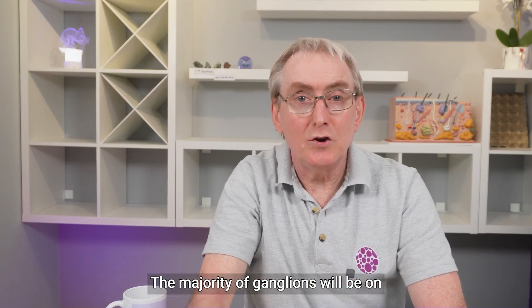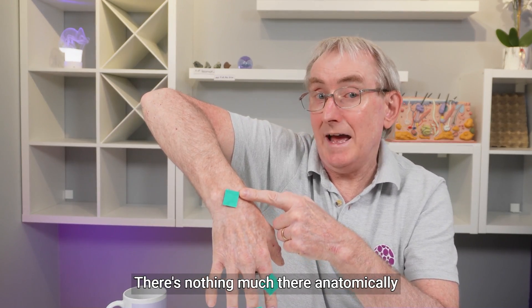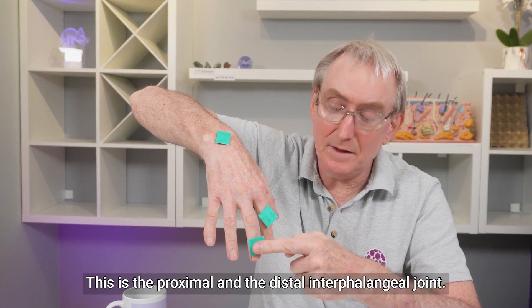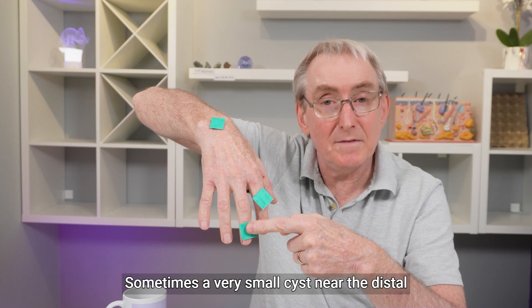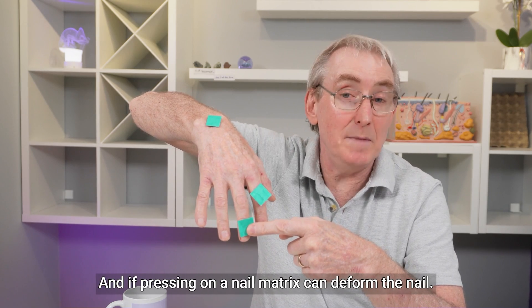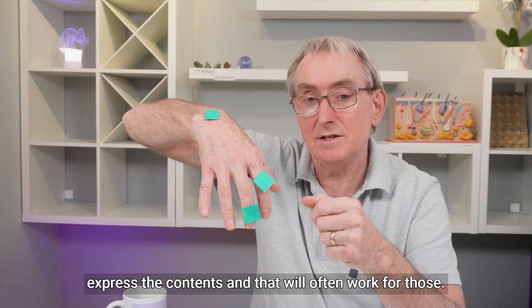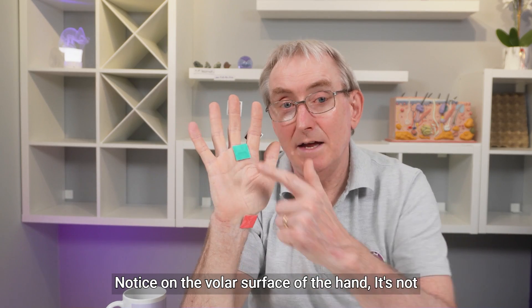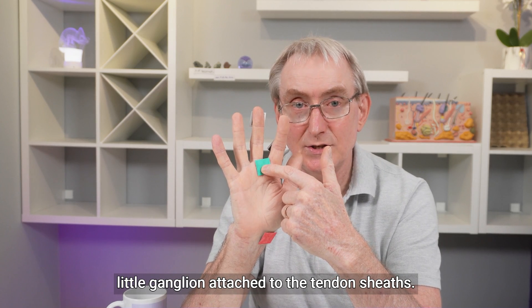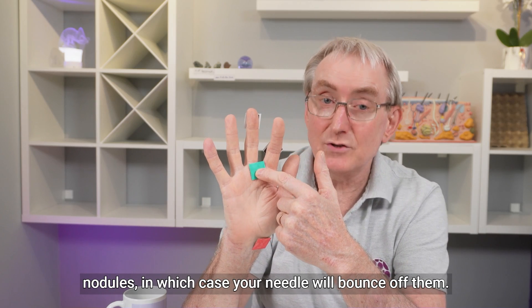The majority of ganglions will be on the patient's hands. The back of the wrist is most common — there's nothing much there anatomically to prevent a safe aspiration. Distal finger joints are also very common. Small cysts near the distal interphalangeal joint are called mucoid cysts; if pressing on the nail matrix, they can deform the nail — a small needle puncture to express the contents will often work for those. On the volar surface, small ganglions attached to tendon sheaths along the palmar crease tend to be firmer and the needle may bounce off them, but very often aspiration will still do the job.